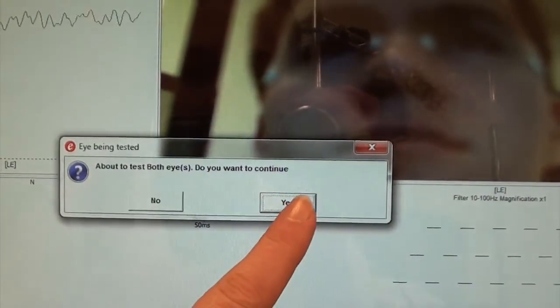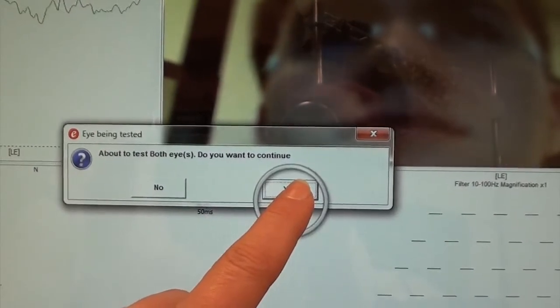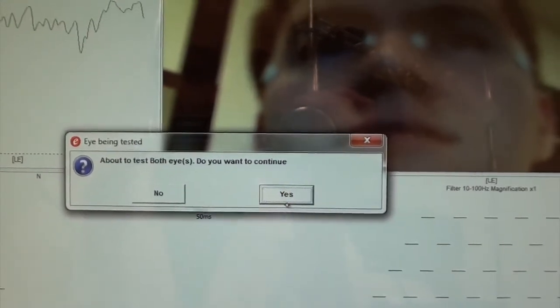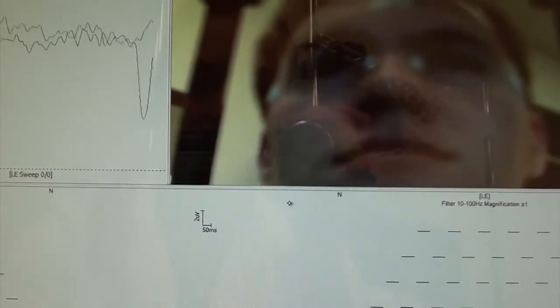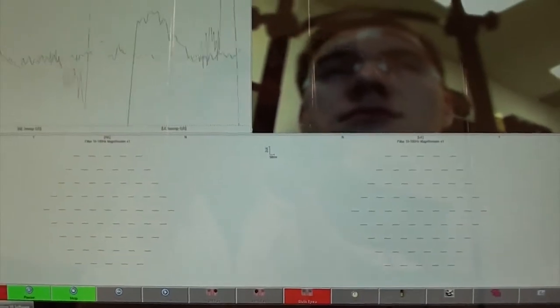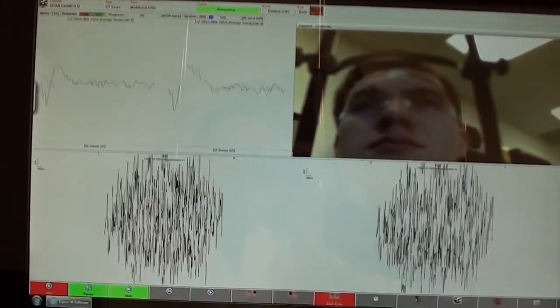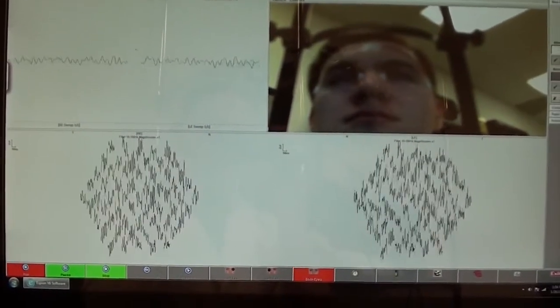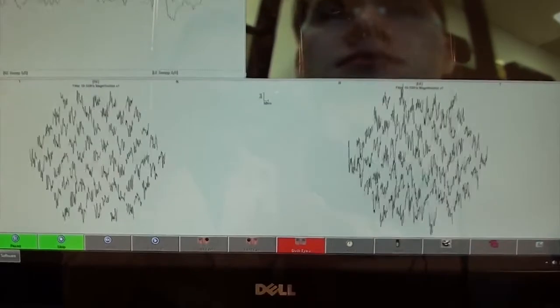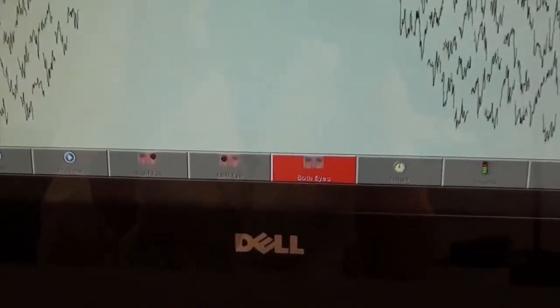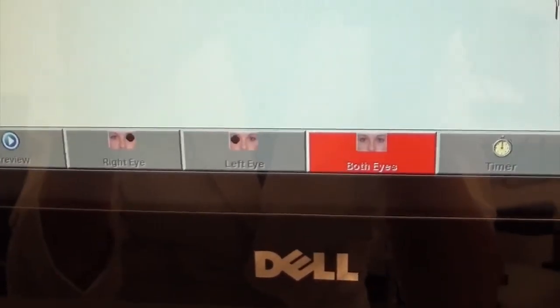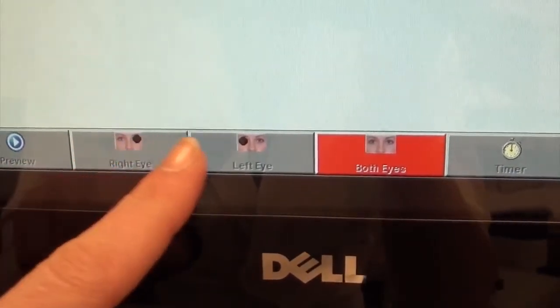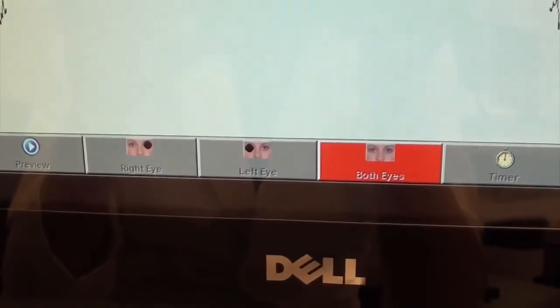Do you want to continue testing both eyes? Yes. And the test begins recording. If you would only like to test one eye, you would choose that here before starting the test.